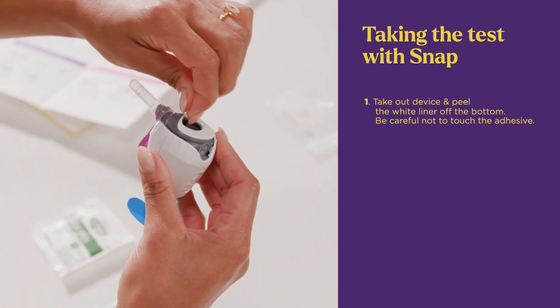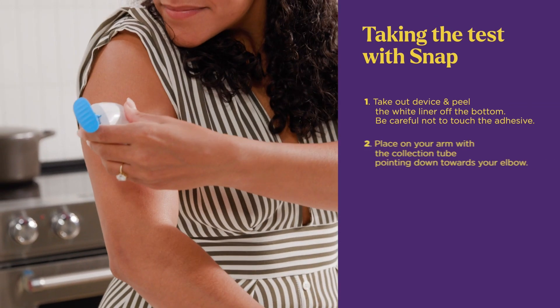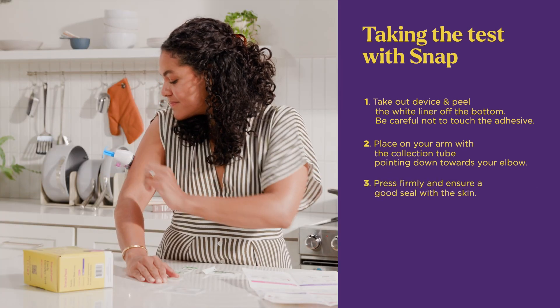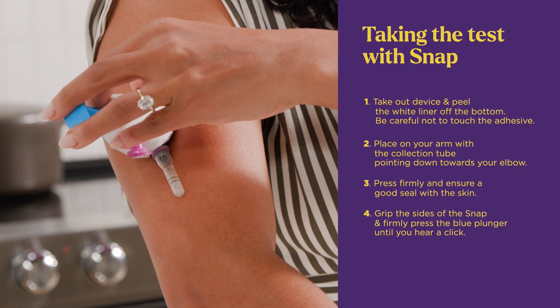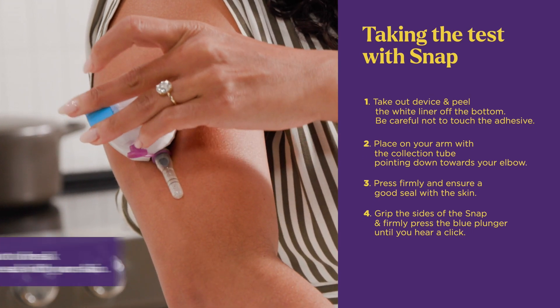Take out your device and peel the white liner off the bottom. Place the snap on your arm with the collection tube pointing down towards your elbow. Press it firmly to your arm and ensure a good seal with the skin. Grip the sides of the snap and firmly press the blue plunger straight in until you hear a click and the plunger is all the way down.